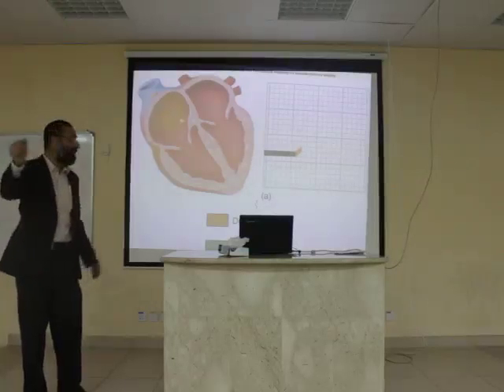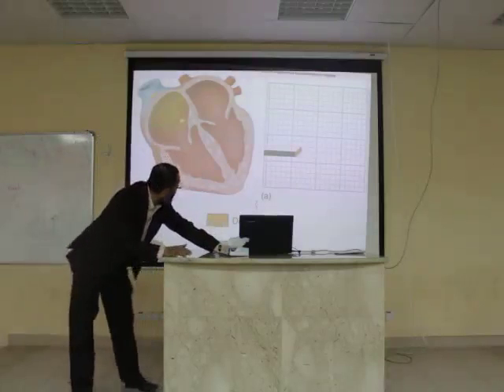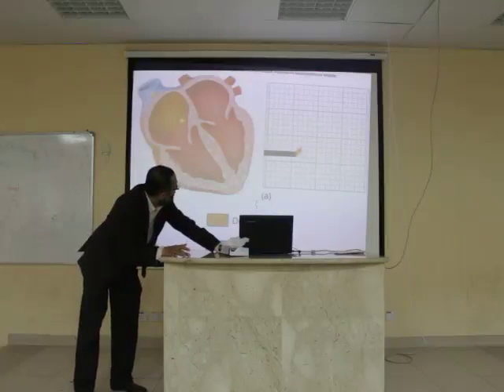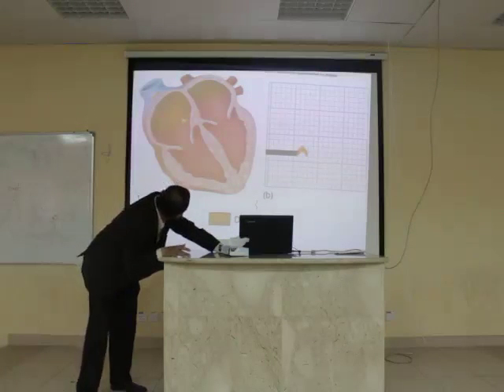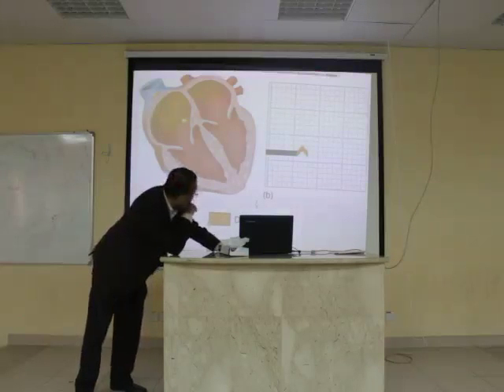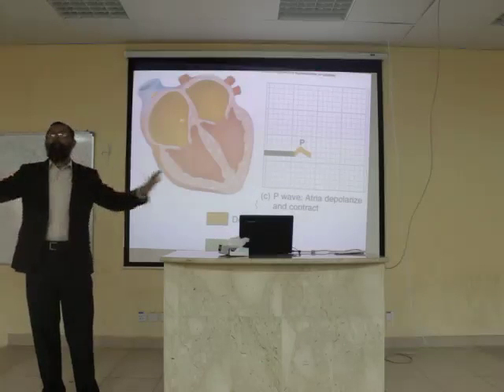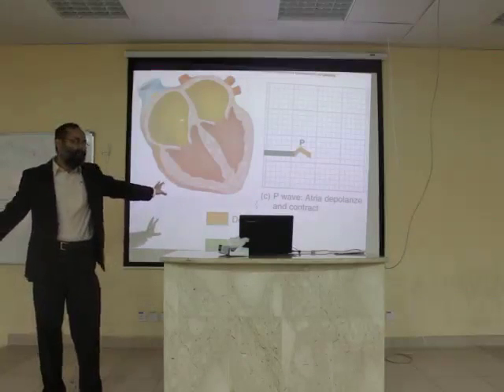Okay. Now, quickly, it's only a visual. Just see what's happening. Look at this part, look at that part. Please keep looking. Okay. See the graph and see the heart. What is forming? And what is happening there? Atria are changing color. What has been done? Both sides atria have depolarized, isn't it? And now the P wave is complete. Do you see that?